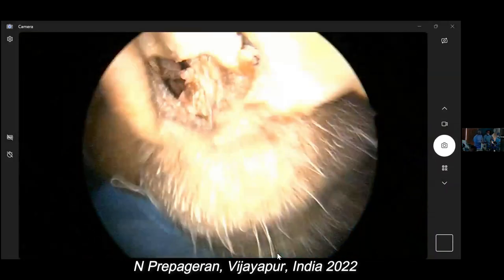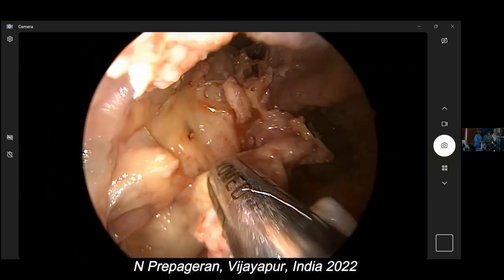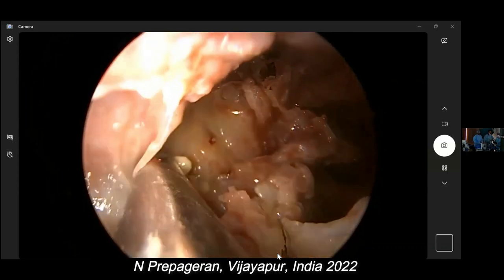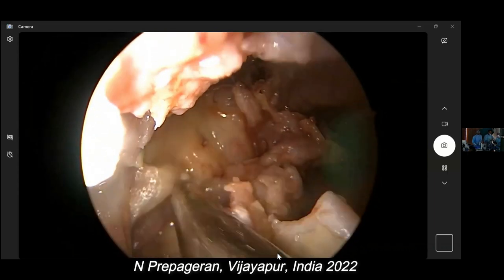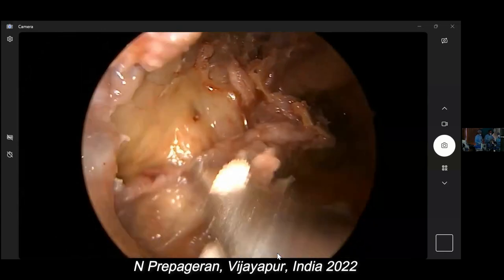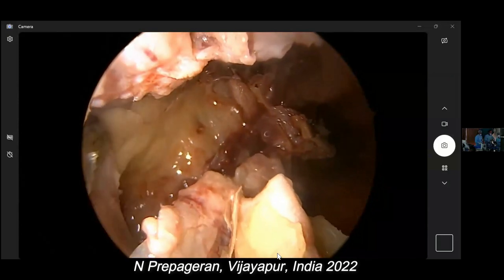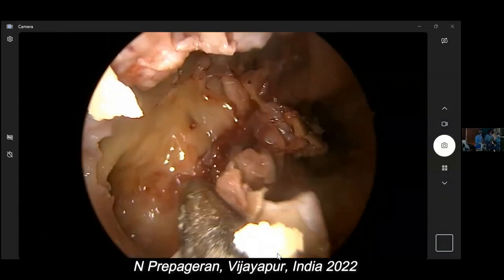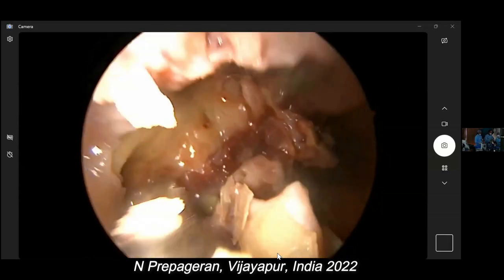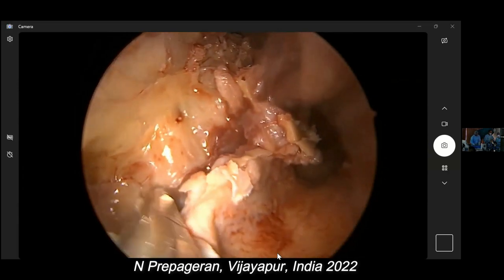Question? So now I'm going to remove the mucosa of the posterior maxillary wall. I can see the infraorbital nerve coming into view. Can you see? If you look at the view, you get to see the entire anterolateral wall of the maxilla with the Denker. Okay, now we have done that.